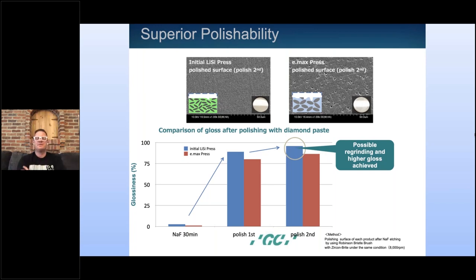Yeah, so I think what I said when I showed that slide is we're at 915. But again, it really doesn't do a whole lot for me to tell you my pressing schedule, because you have to take the pressing schedule from the manual and then make adjustments as you need to. Normally that's only with the high temp. So you start there, I think it said 905 or 903 or something like that, and then you go up in 5 degree increments until you are getting really great pressings with that. So basically that's what I had to do, and we're up to, I think, 915, like I said, for high temp. And I can't remember the hold time. We might've adjusted that a little bit too.